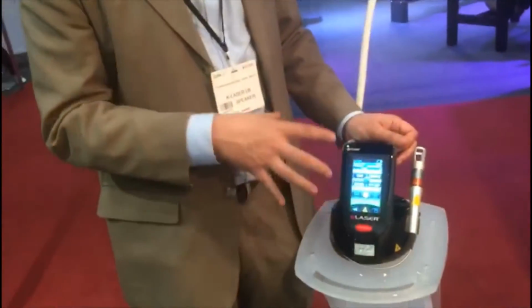So when we're treating people with disc problems, somebody presenting with, say, a herniated disc, they may have muscle spasm, we can't necessarily pinpoint the source of the pain, there might be lots of things going on. What is the laser primarily going to do when we're not exactly sure what's causing the pain? At the levels we're talking about, there's a degree of analgesia. So the first and primary effect will be analgesia, and some of it localized anti-inflammatory, because the impingement of the disc will be causing some sort of pressure aspect. Long-term though, if you're using this on a chronic basis, alongside something like the IDD.